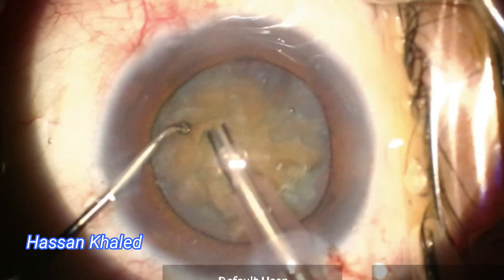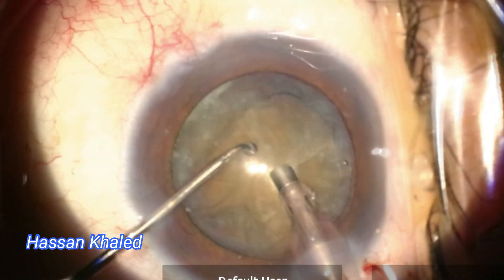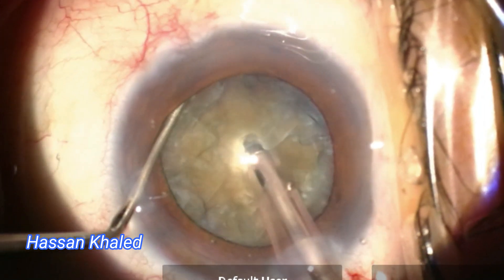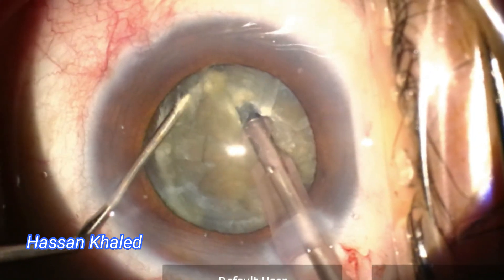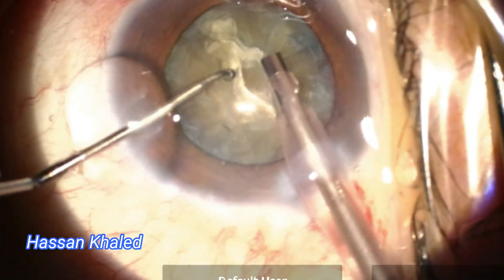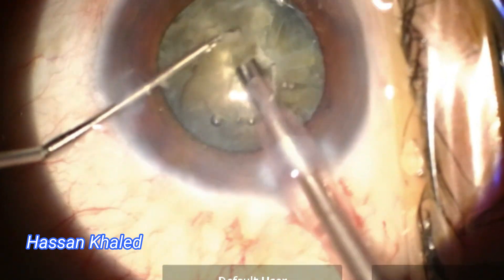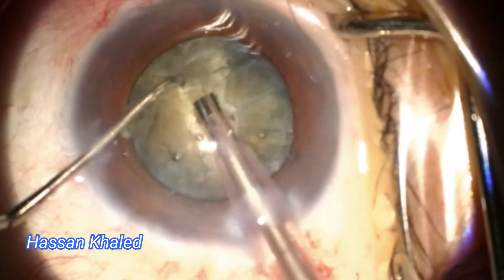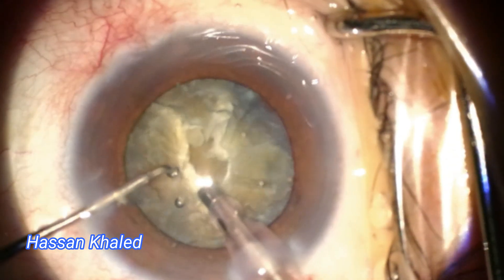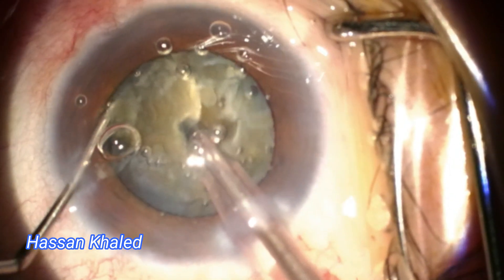So I started emulsification of this dense cataract using the horizontal chop technique. While chopping, I felt something strange regarding the capsular stability and also regarding the zonule — I felt there is general zonular weakness.